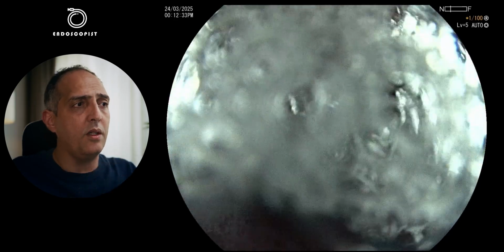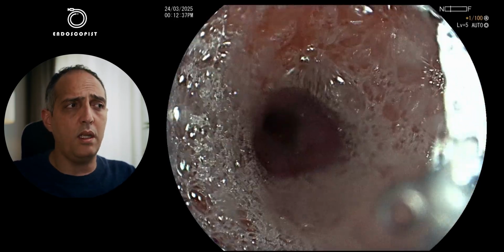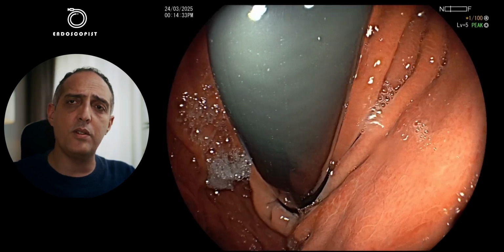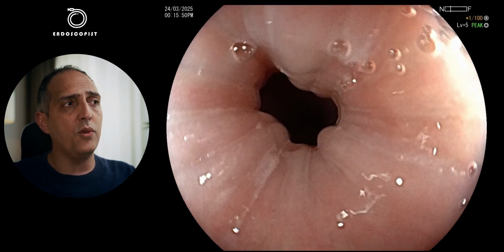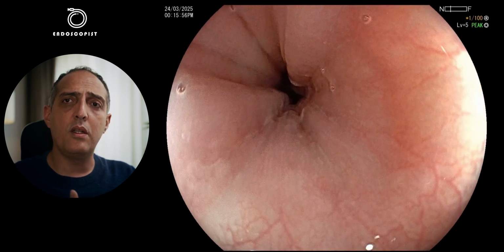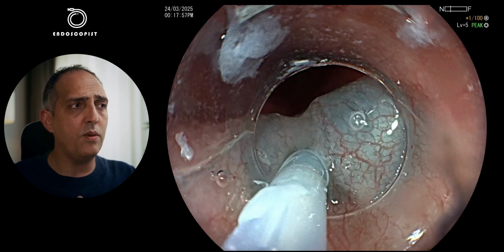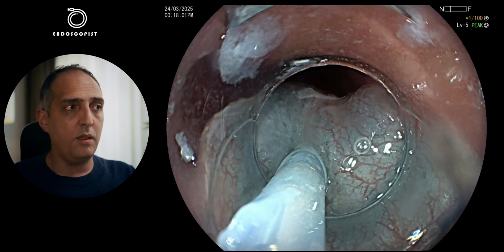We started here with diagnostic endoscopy. As you can see, there is foam, and always in any upper endoscopy, when you see foam and bubbles in the esophagus and a tubular esophagus, you have always to suspect esophageal motility disorder. As you can see, we have spasm at the cardia, and we can also see some tertiary contractions within the esophagus. After we took our measurements, we start with the injection of normal saline mixed with some methylene blue.